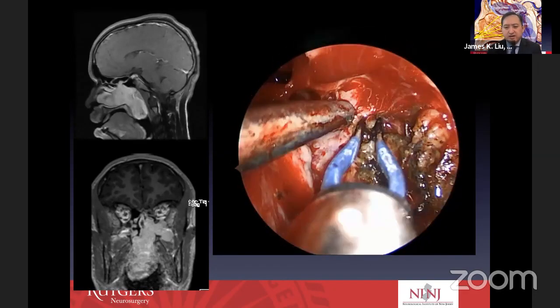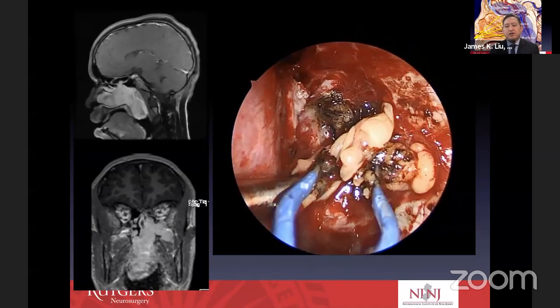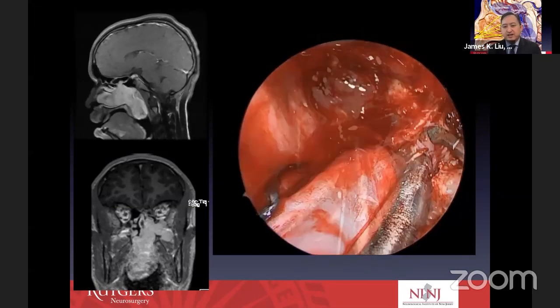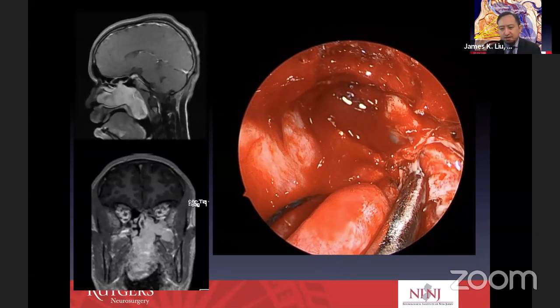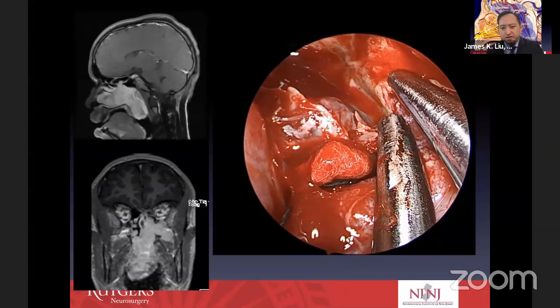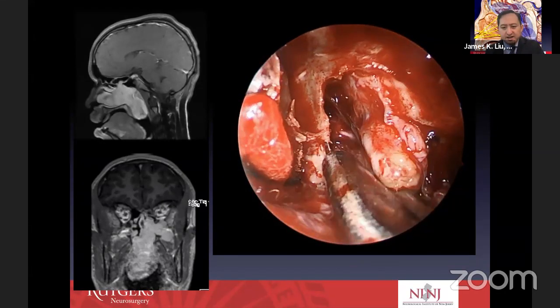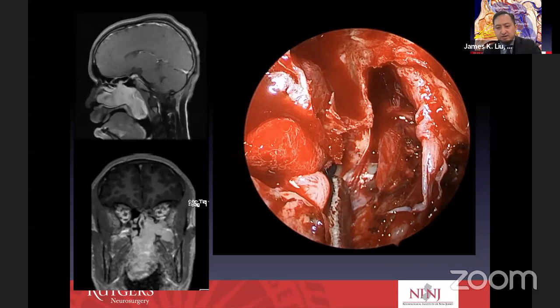And so we embolize these with preoperative embolization, but it's also important to access the blood supply early. So here we are accessing the infratemporal fossa. We've opened up that fat pad and we coagulated that sphenopalatine internal maxillary artery. And these tumors are benign and they'll have a nice capsule and they'll typically erode into little nooks and crannies of the skull base. And here there's a small finger of tumor going into the inferior orbital fissure. So we'll look for that fat pad and dissect the tumor capsule away from the fat and away from the pterygoid plate. So there's tumor lateral to the pterygoid plate.